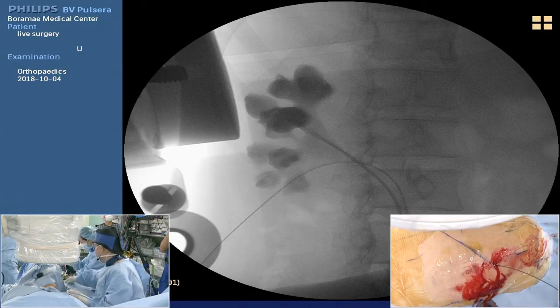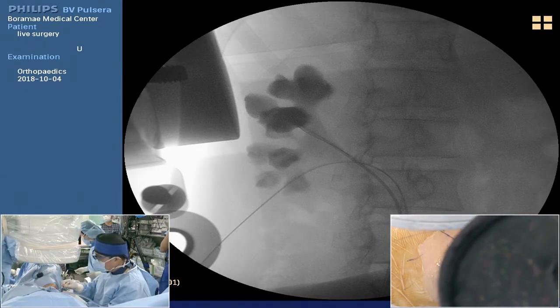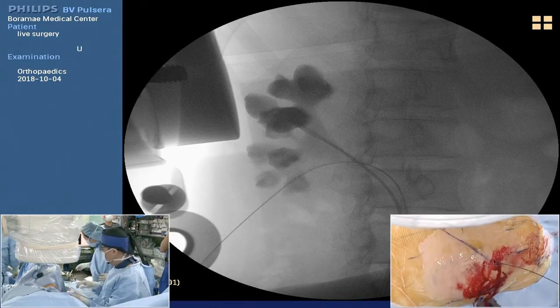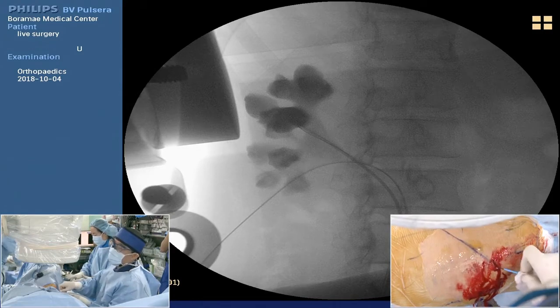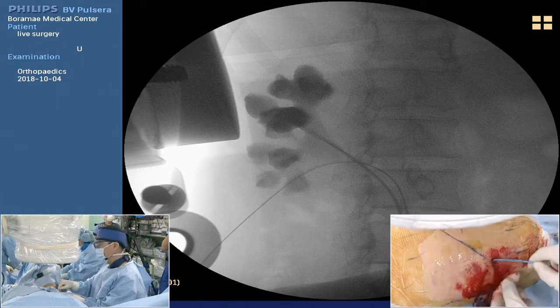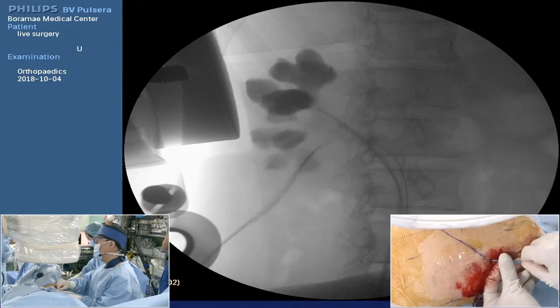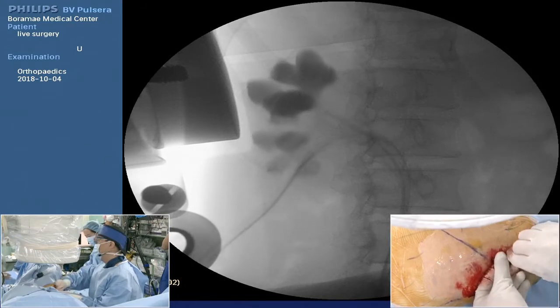So please give me the knife, please. I extend the skin incision. I'm sorry. Which will be the final size of your access sheath? You mean the percutaneous balloon or accessories in the ureter? The percutaneous balloon. I'll use the 18 French balloon dilatation today. So your access sheath to the kidney will be 18 French wide. Yeah, right. 18 French, and the scope is 16 French.